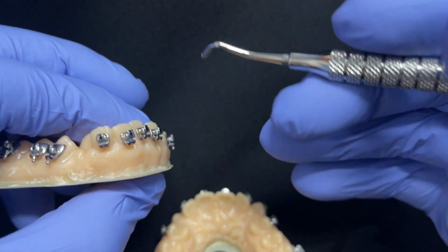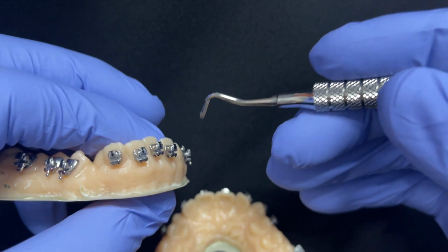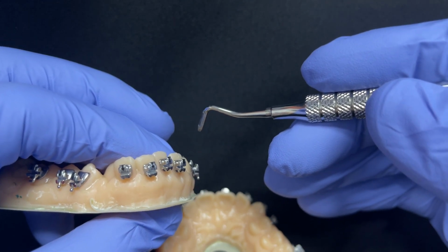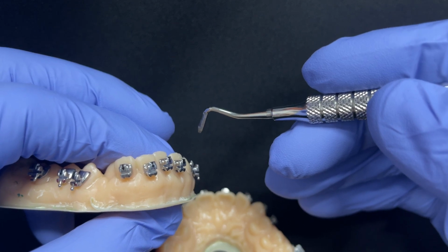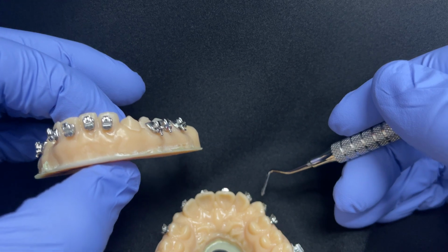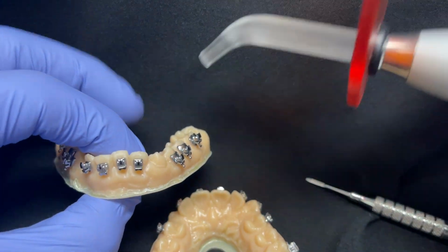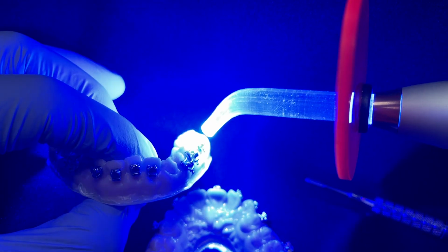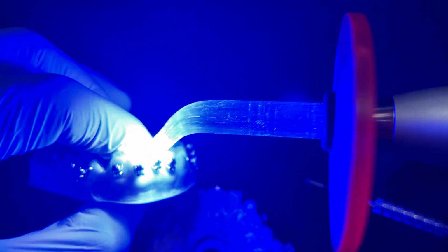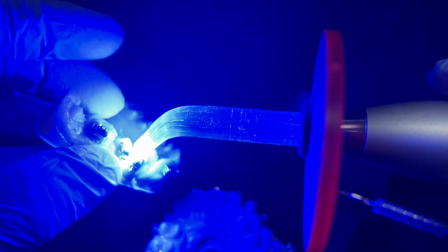Now in this case, because of the severe depth of the bite, it's an impinging deep bite, so we'll be putting on bite turbos on day 1. Probably some open coil springs in all these cuspid areas, perhaps except for the upper maxillary left cuspid. Once we get these brackets placed, we just hit them with a curing light. It doesn't take much, just to keep them from getting bumped as we take them back to the lab to make our indirect bonding tray.